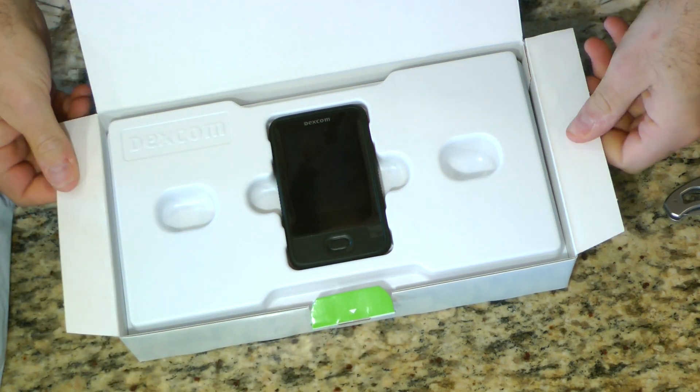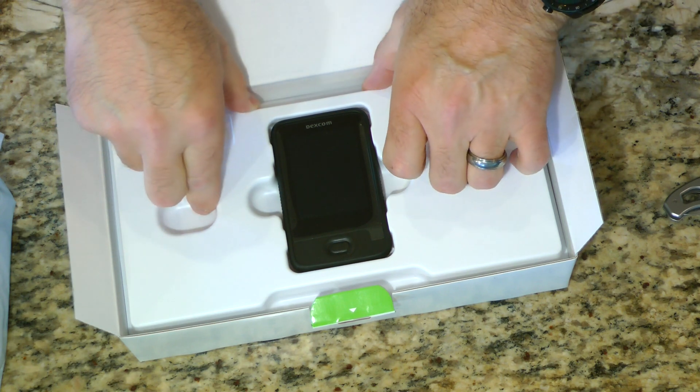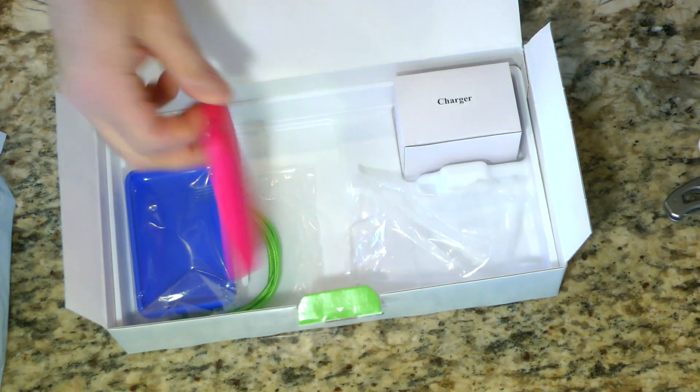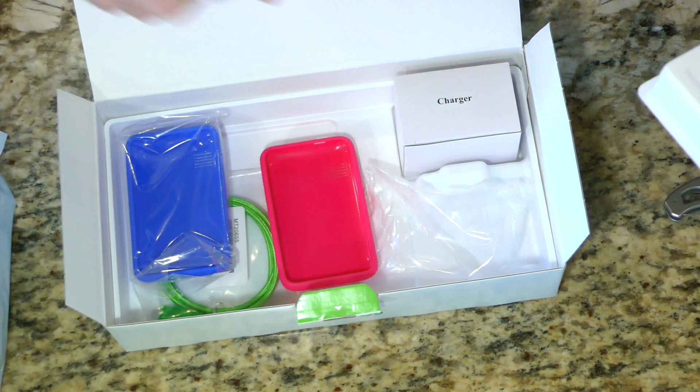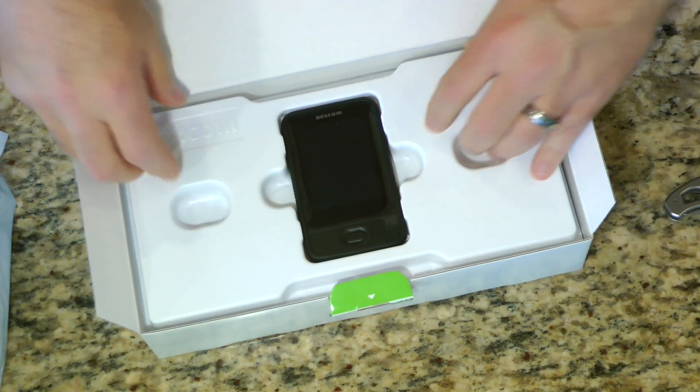Oh, wow. Now my understanding is I'm not going to be using this receiver very much because the G6 is integrated with the T-Slim. But it comes with, looks like, some little silicone cases, a USB cable, and a charger. So fun stuff.